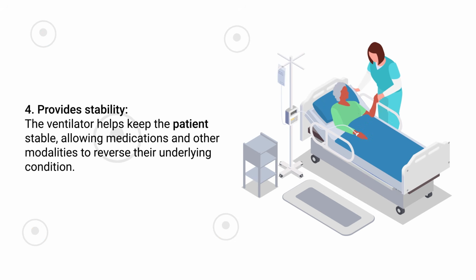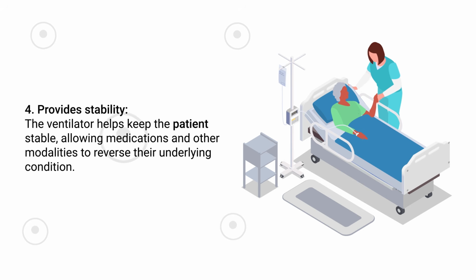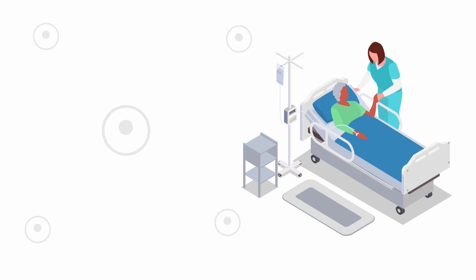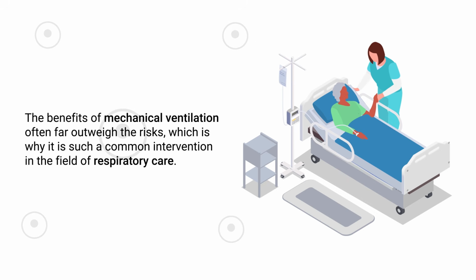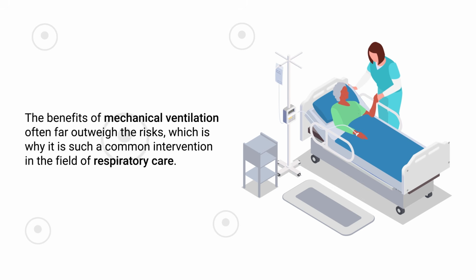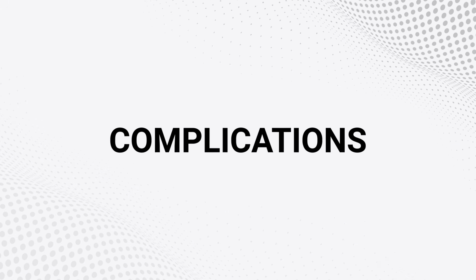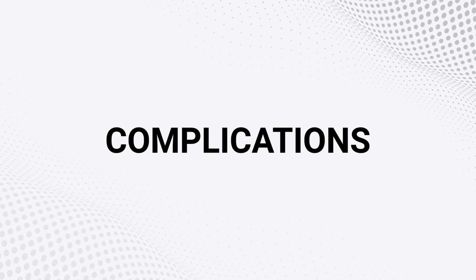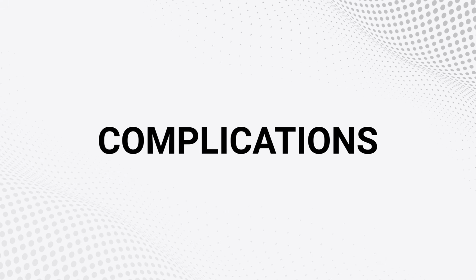And it provides stability. The ventilator helps keep the patient stable, allowing medications and other modalities to reverse their underlying condition. The benefits of mechanical ventilation often far outweigh the risk, which is why it is such a common intervention in the field of respiratory care. However, there are some complications that can occur. Some of the most common risks and complications of mechanical ventilation include the following.